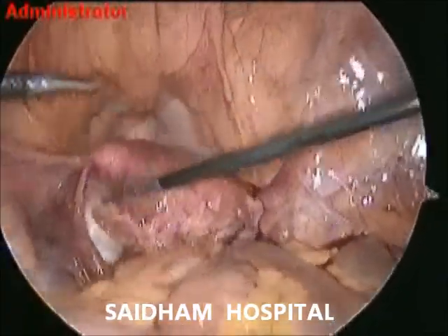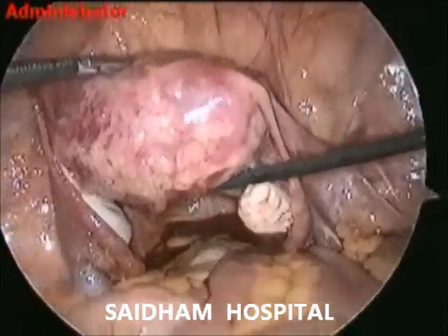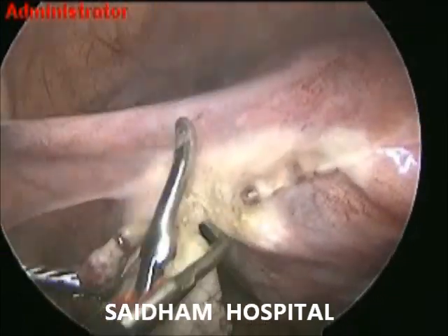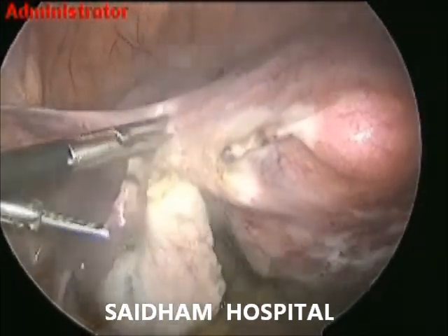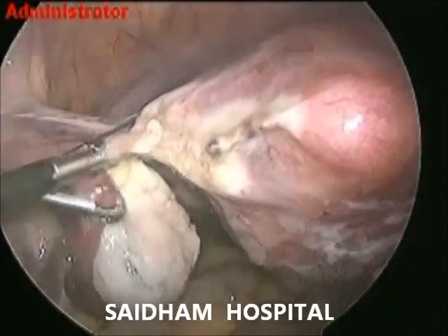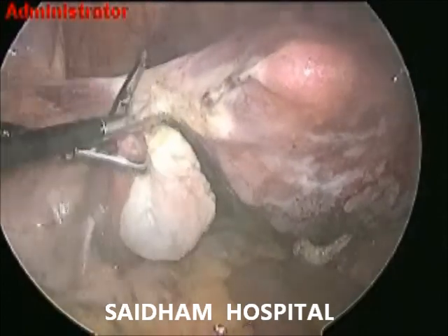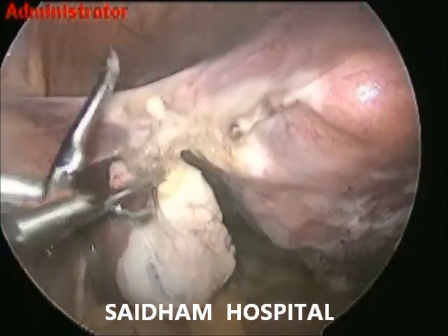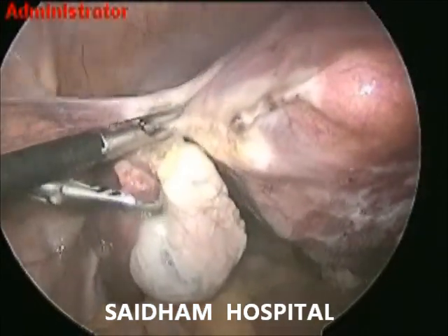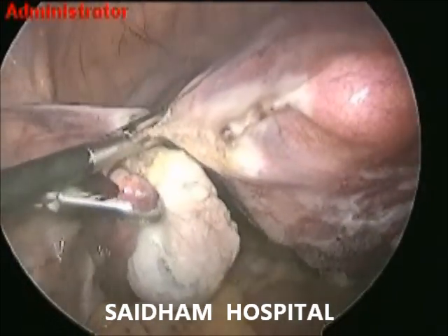This is a very commonly encountered issue in TLH in gynecologic setup. Endometriosis is a disease with different behavior. In this disease, surrounding tissues can be irritated, eventually developing scar tissue, adhesions, and abnormal bands of fibrous tissue that can cause pelvic tissues and organs to stick to each other.